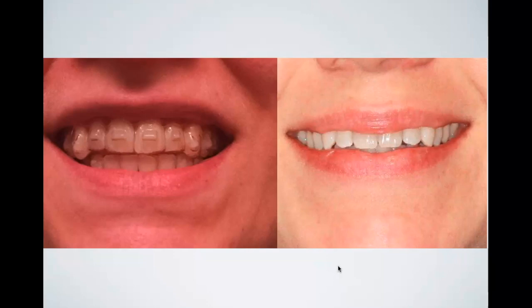And additionally, you can engage the undercuts completely, because before, if you have all the attachments on the teeth and you engage the undercuts completely, you're not going to be able to get the aligner off, and there's nothing you can do about it because it's not really thermoactive at all. But if you have a thermoactive material, then what happens is, if the aligner's too tight, you engage too many of the undercuts and they can't get it off, then you just rinse your mouth with warm water, and that warm water makes the aligner flimsier, basically, and allows you to get it off.